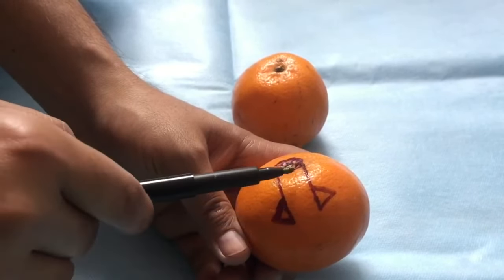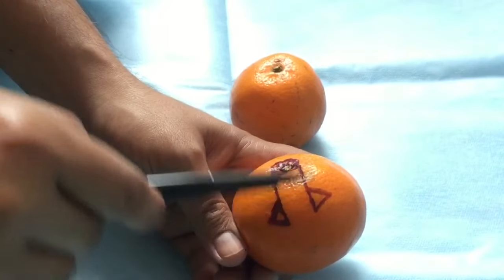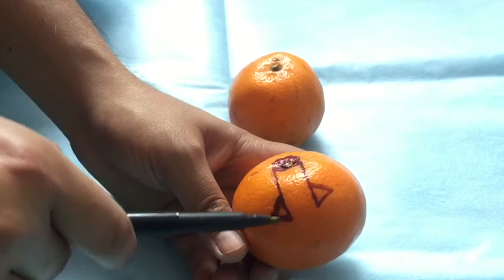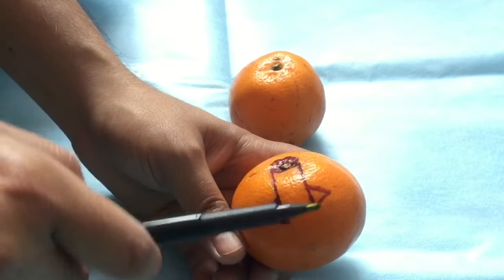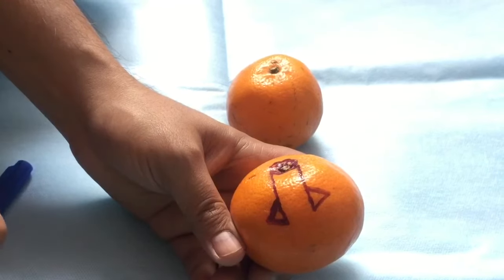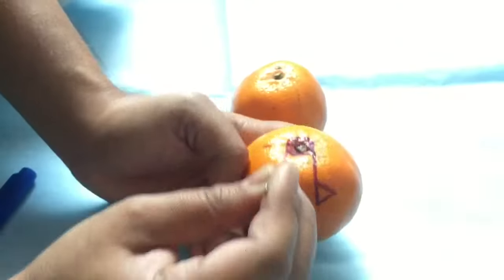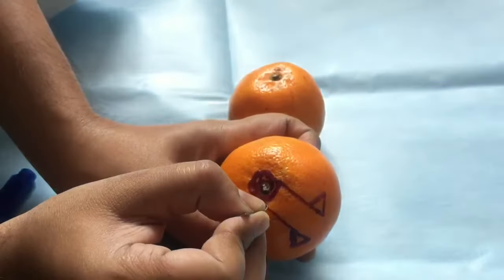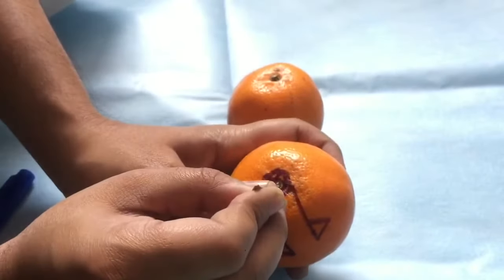If the ratio exceeds 1:4, you will have to widen the flap at the base region, otherwise your flap will get necrosed — it will get deprived of blood supply. So let us first excise the lesion; I'm using a surgical blade.